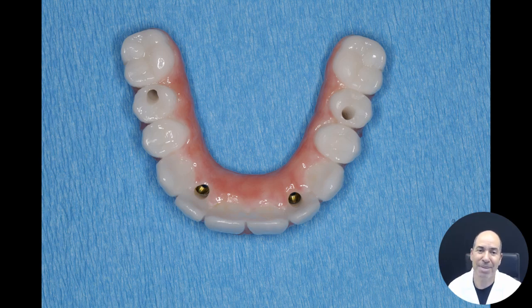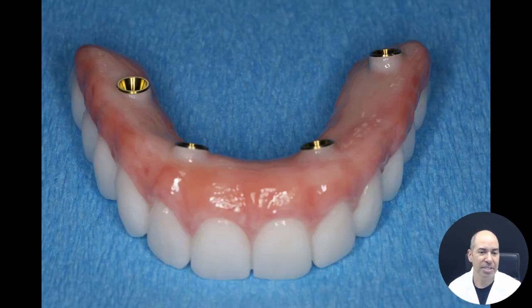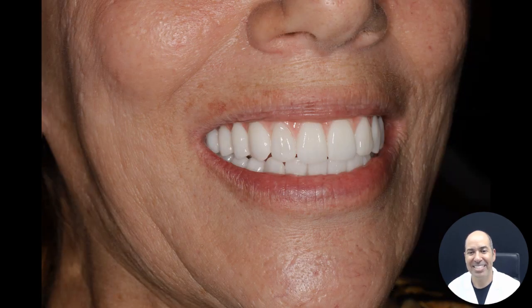It's important that you have maintenance. You're going to come in every 6 months to the office. We're going to use an airflow to clean, not just scrapers. And here you can see we call this the intaglio surface, how this fits so perfectly. And here's what she looks like at the end. I think she looks amazing.